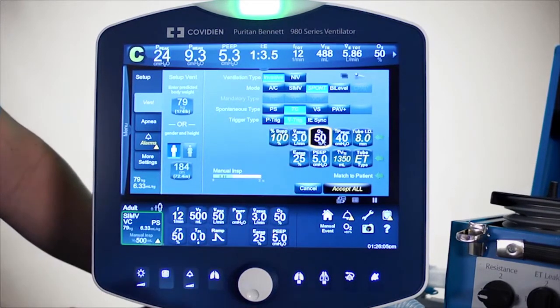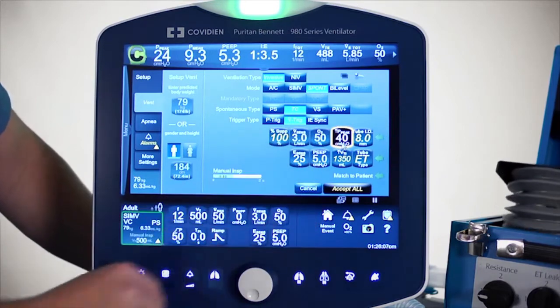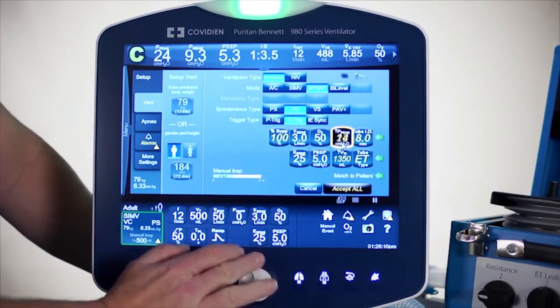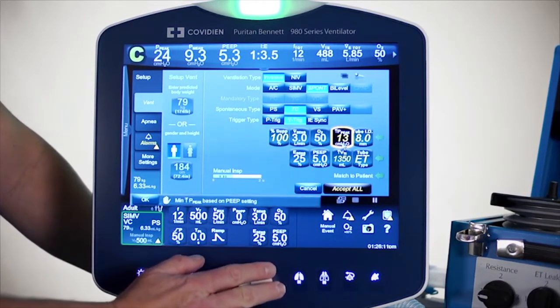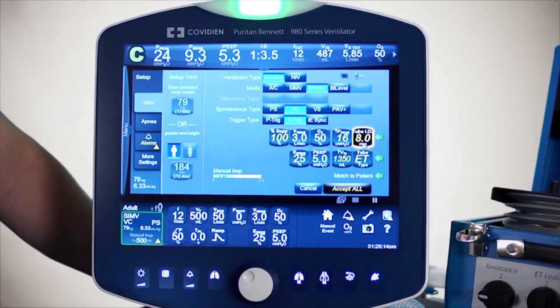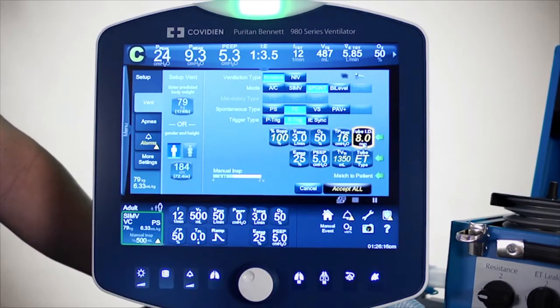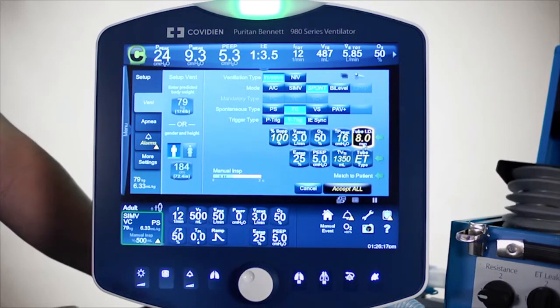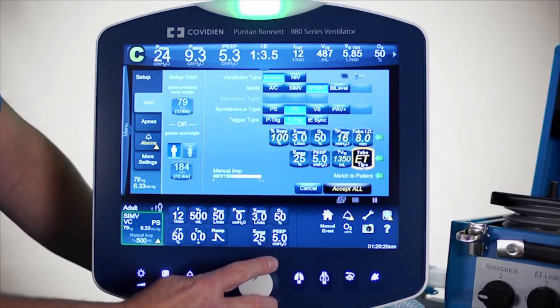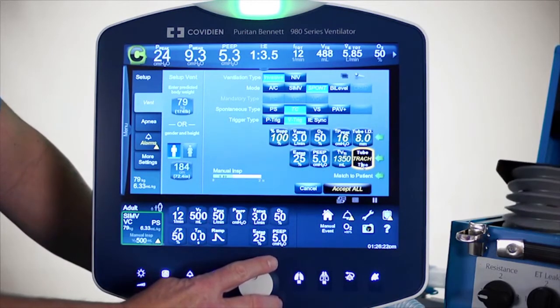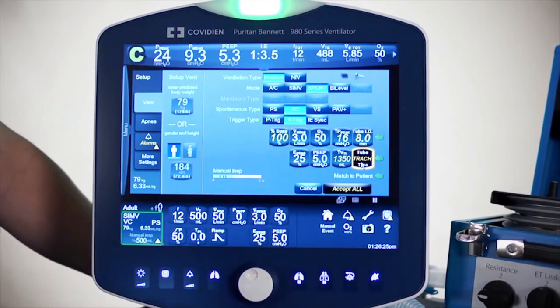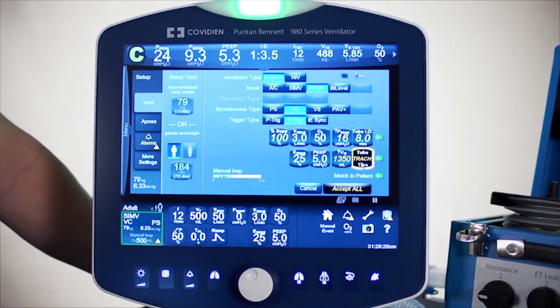O2 percentage and high peak pressure alarm — I won't need that much for this scenario. Here's where you get into the inner diameter of the endotracheal tube. And then you also have the option of selecting whether it is an endotracheal tube or a tracheostomy tube. So you put in the inner diameter size as well as the type of tube.